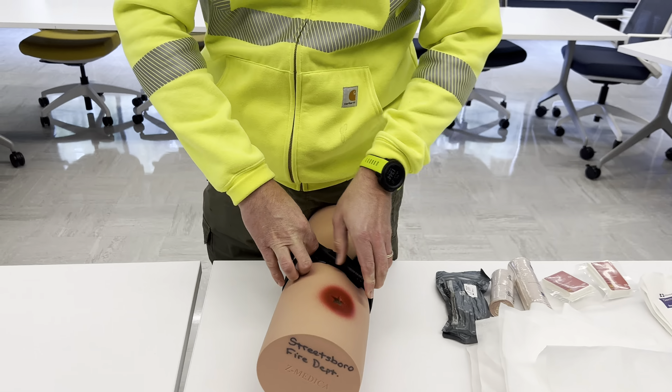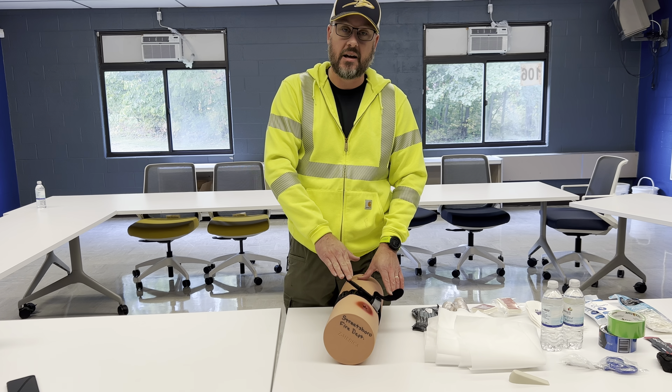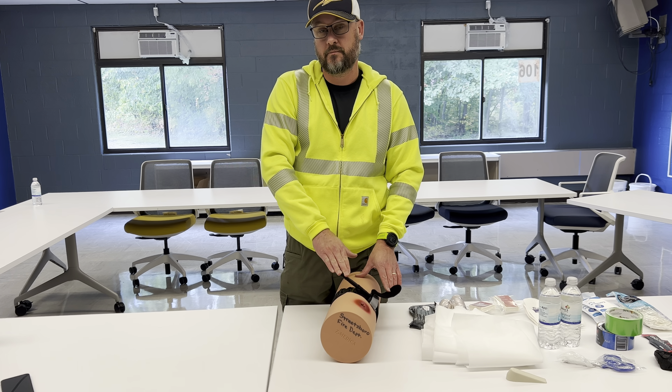Quick note: this is going to hurt a lot. The number of twists and turns it takes to stop blood flow means the tourniquet itself will generate significant pain for the patient. Keep that in mind — don't stop even if they tell you to stop, because you need to save their life by stopping the blood flow. Thanks.